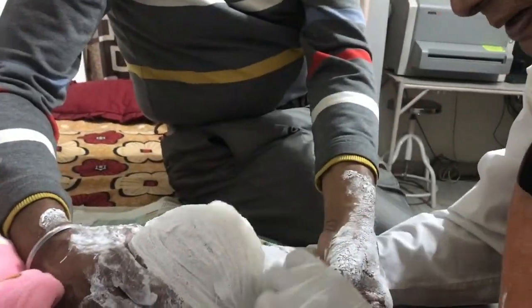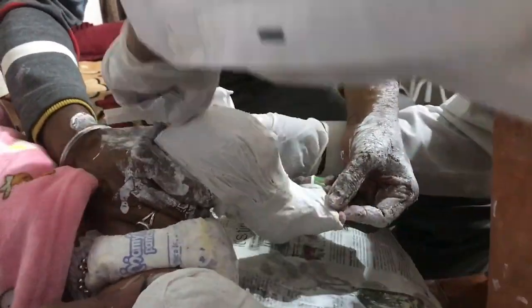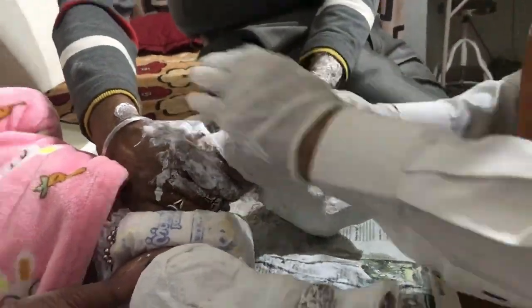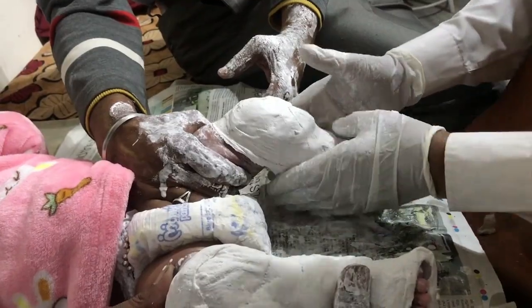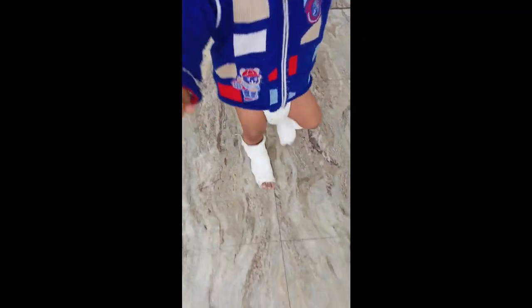If the deformity gets corrected early before the walking age, a custom-fit below-knee single or double posterior plaster mold is applied in an overcorrected position and advised until the child starts walking. The results will surely prevent relapses and under-corrections as reported in the literature, if the treatment is given in infancy.